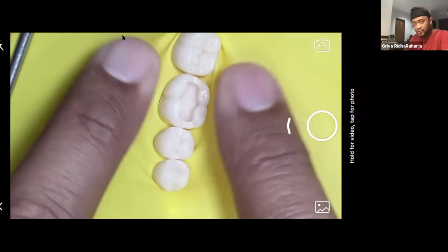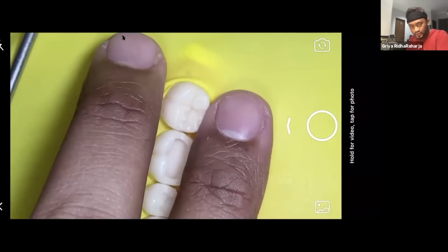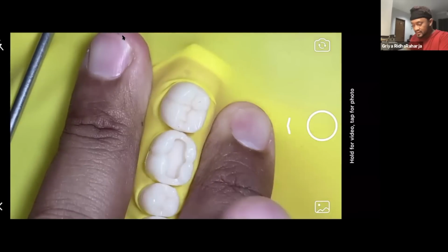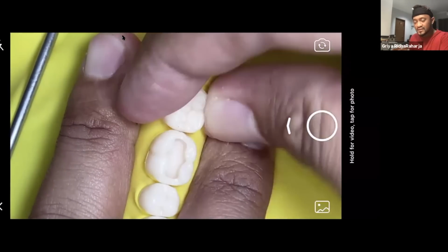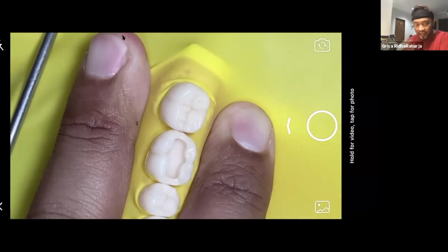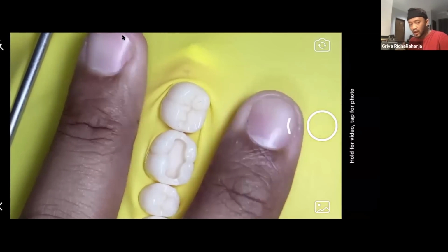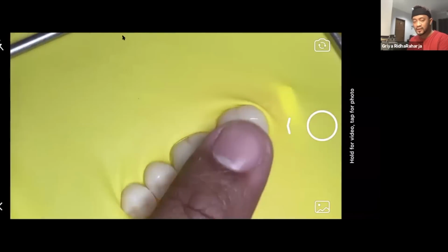And then after you reach the last one, you put your finger like this, and then put the clamp. Okay, this is the easy way. Then you place the clamp first, and then your sheet. So me and Rizal are always doing it like this. Put the sheet first, and then the clamp.